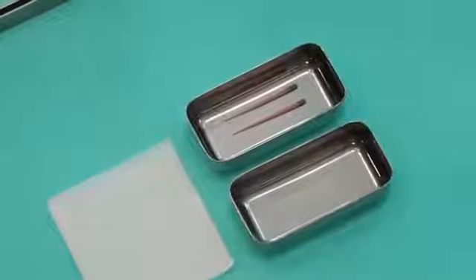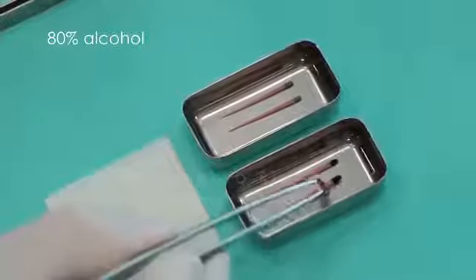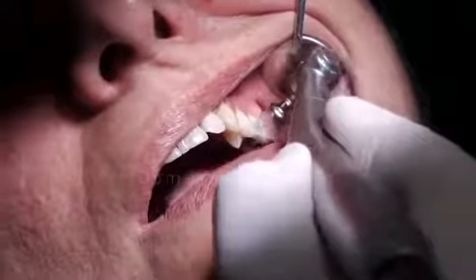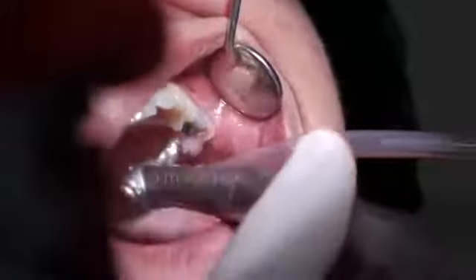At the second visit, a week later, the patient reported no postoperative pain and the tooth was comfortable. Preliminarily, 4 selected gutta-percha points were immersed in 80% alcohol for disinfection. Prophylaxis was accomplished with a brush and a prophylactic paste. The tooth was isolated with a rubber dam.